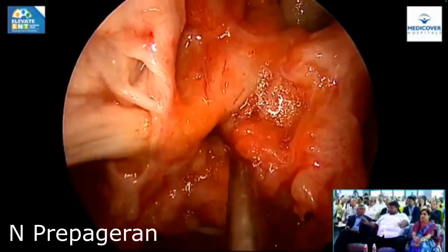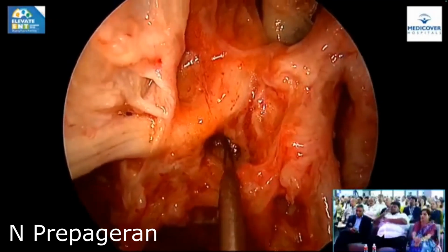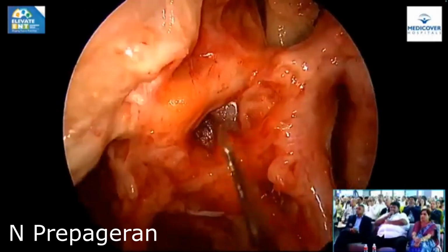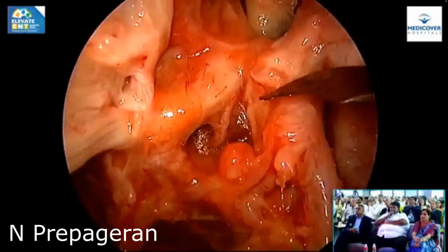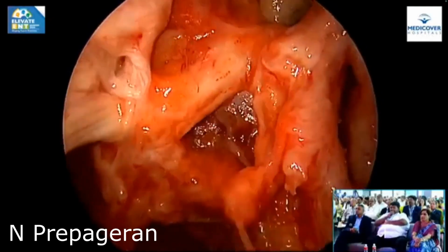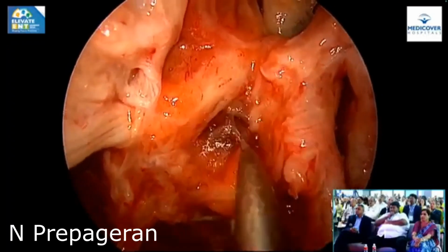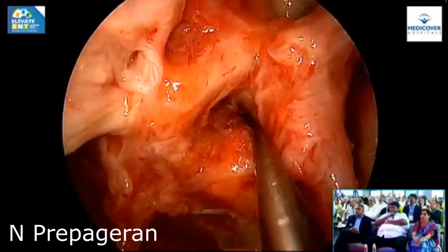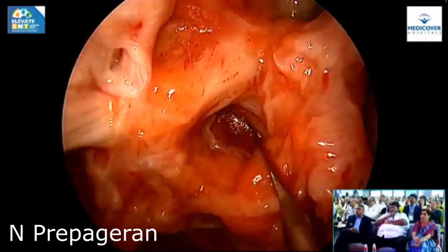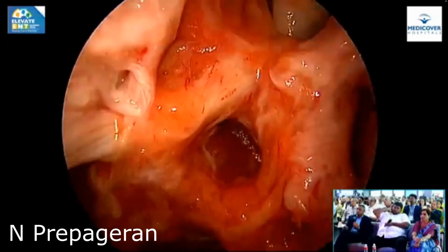Yeah? The next step, I think I'm going to use a piece of gauze or something. There's a lot of fat, so I need some piece of gauze. So I'm going to cut the ganglion. Okay, so now I'm going to push this. I've already cut the pterygopalatine ganglion now. I'm going to push this away. Can you see the lateral face of the pterygoid? Wait, let me get a piece of gauze, fine. Can you see, guys? This is just pterygoid, the lateral wing, lateral pterygoid plate.